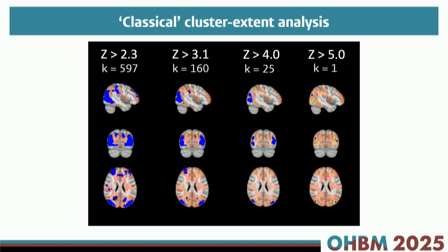So the thing is that we have to decide beforehand which threshold to use. And this is a problem if you don't know your data, and you cannot choose it afterwards. You have to choose it before seeing the data. And then you have to decide on a Z threshold, and then you have to, well, basically stick with it. And of course, you could say, I see, for example, with this threshold, that my data is way too blobby. I find too large activations.